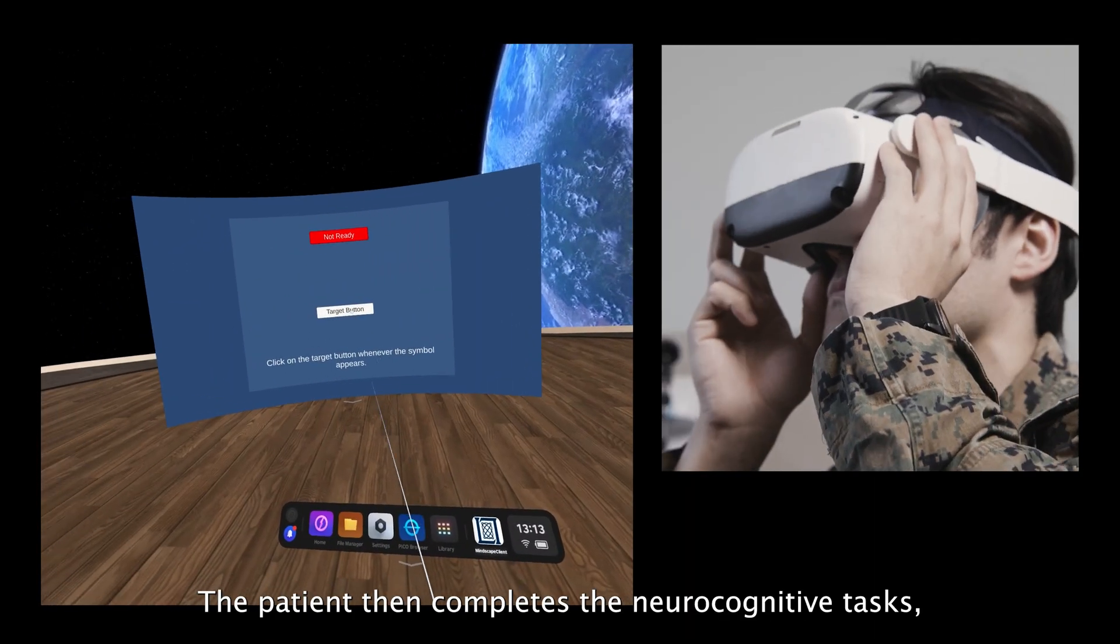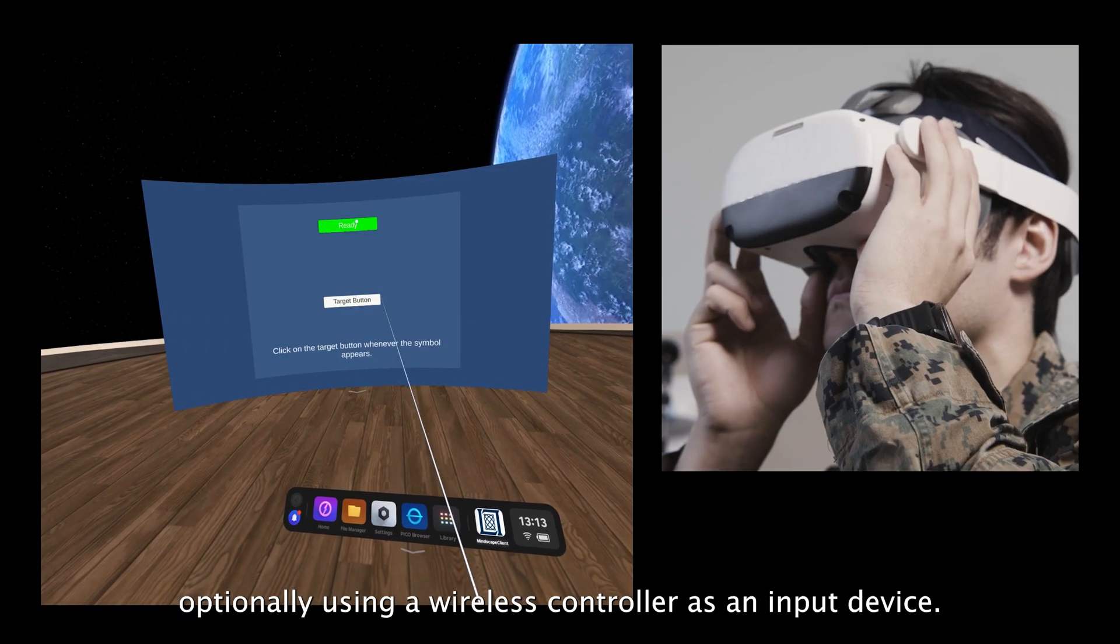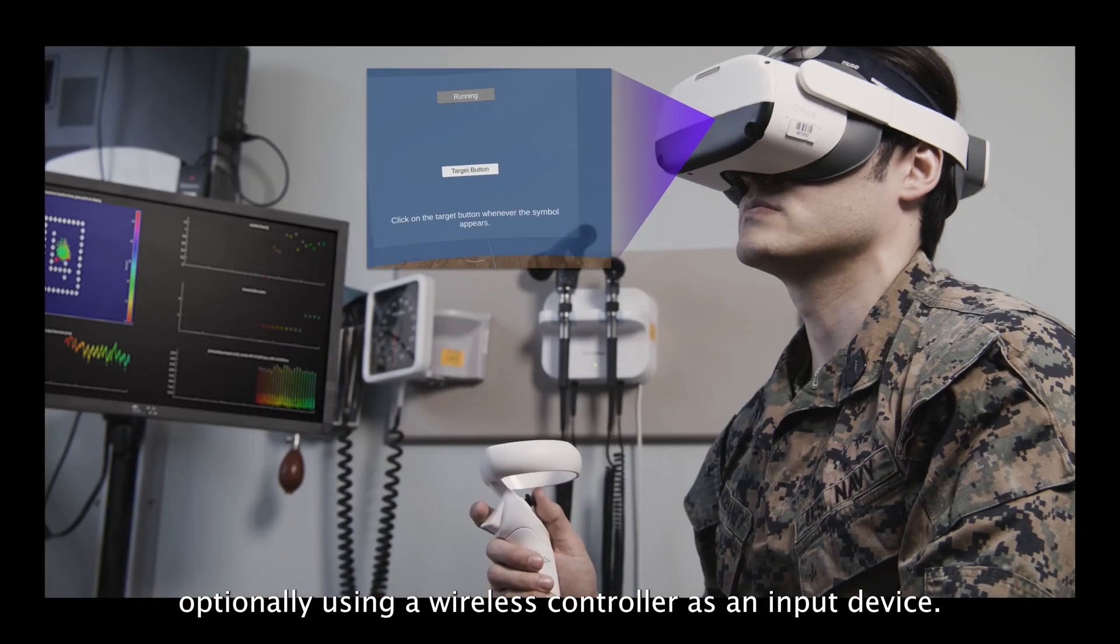The patient then completes the neurocognitive tasks, optionally using a wireless controller as an input device.